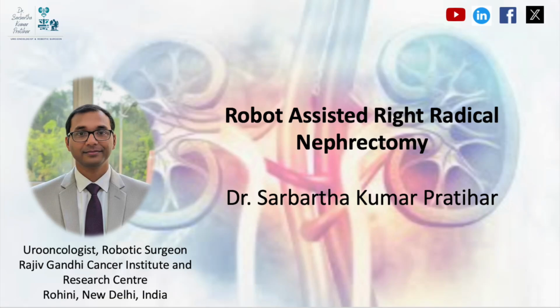Hello everyone. Today I am going to demonstrate robot-assisted right radical nephrectomy. I have done very minimal editing of the surgical steps so that it can be reproduced.